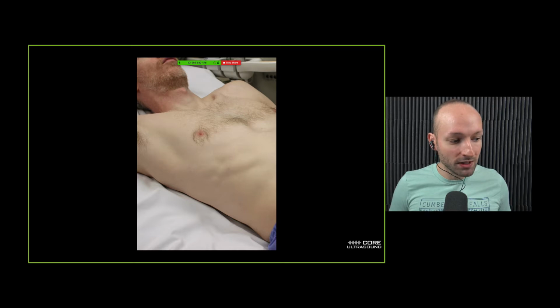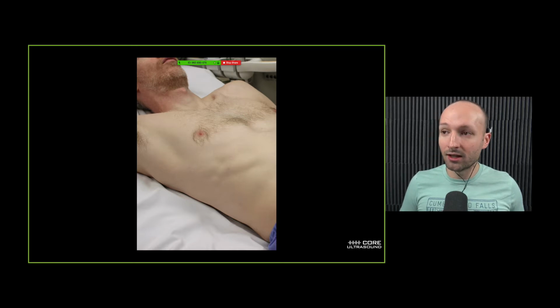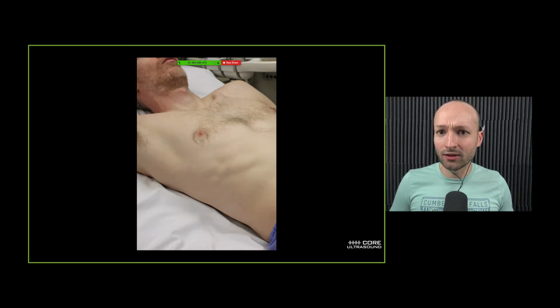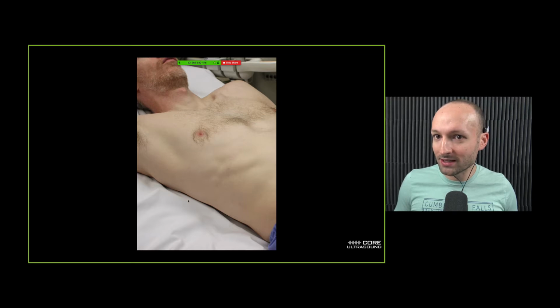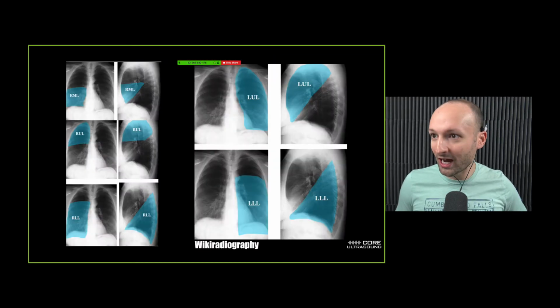We can look lateral. Now, the problem with this in lung infections is that the lobes of the lung, you have to look at the lower lobes. And it's not that this down here at the base is like the lower lobe. That's actually not how it works.